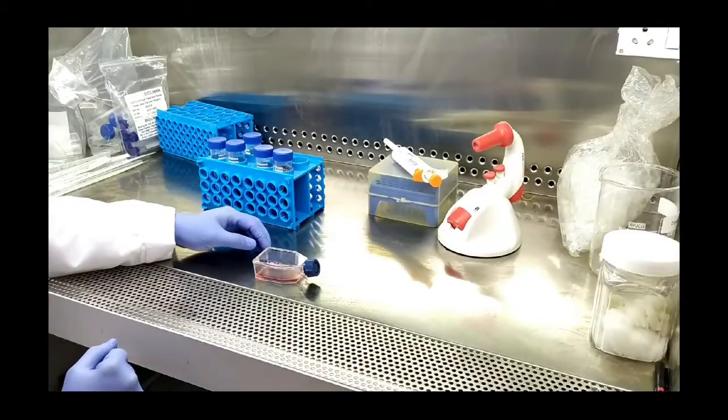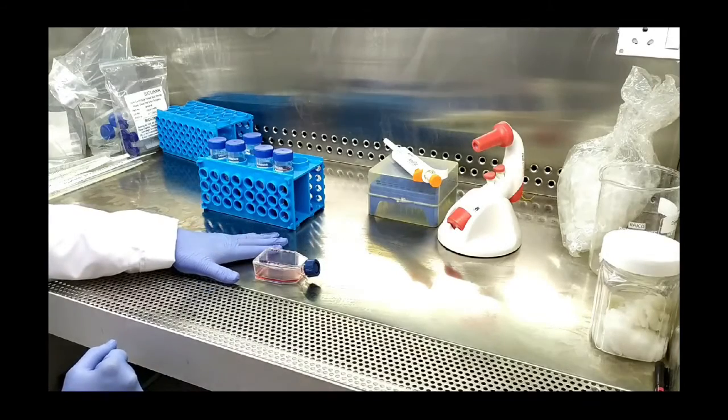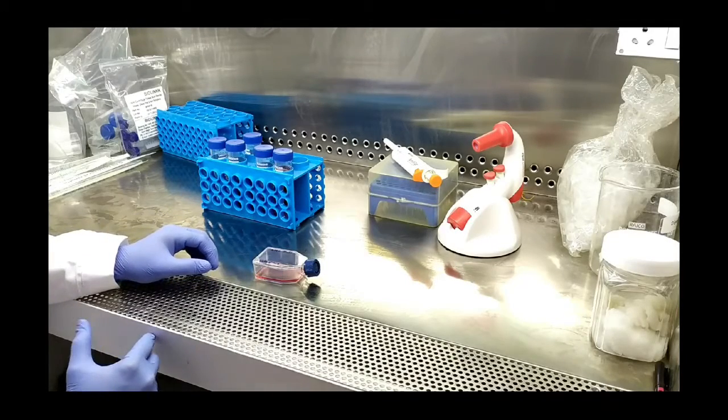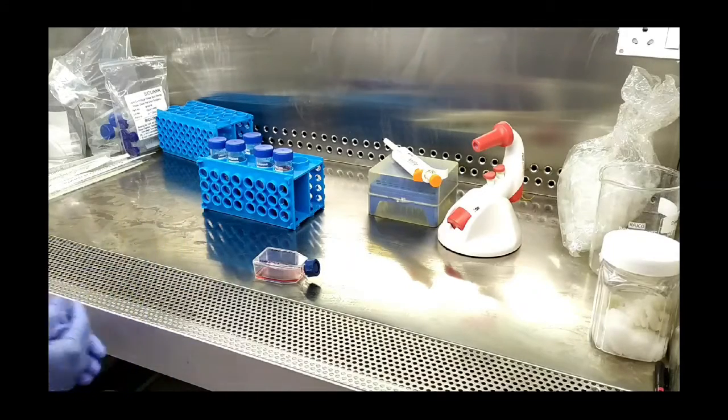In today's session, we are going to passage A549 cells, which are adenocarcinomic human alveolar basal epithelial cells constituting a cell line that was developed in 1972 from an old Caucasian male. This cell line is procured from the repository of various cell lines. Before doing the process of passaging, we are going to observe the cells obtained from the cell repository under the microscope for their morphology, and then we will proceed further.